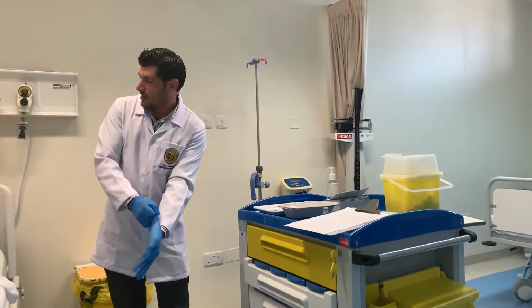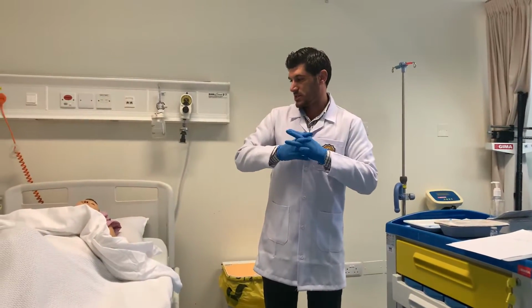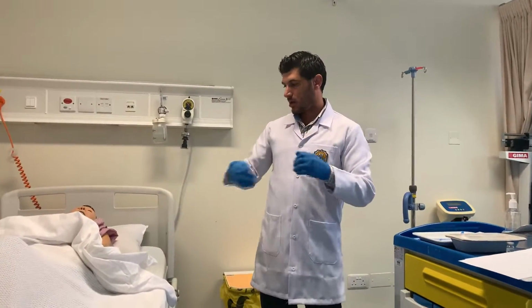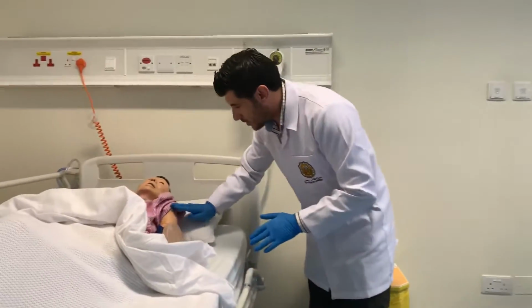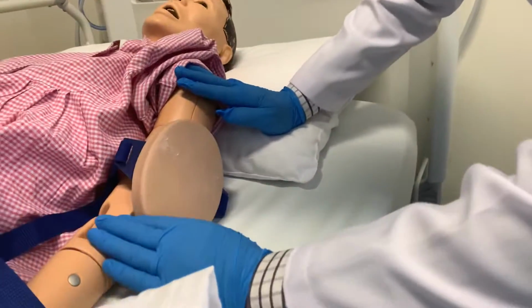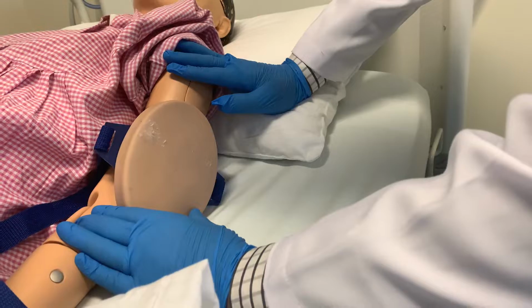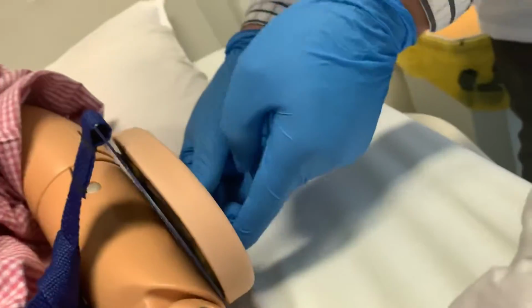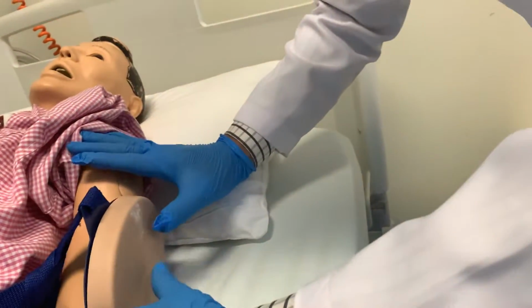We know that the subcutaneous injection can be given in at least three different sites. One of them, which we are going to use, is the upper arm, and we can locate it from the acromion process, three fingers, and the elbow, three fingers. So the area is the middle lateral area here. Three fingers, three fingers. This is the area to give.